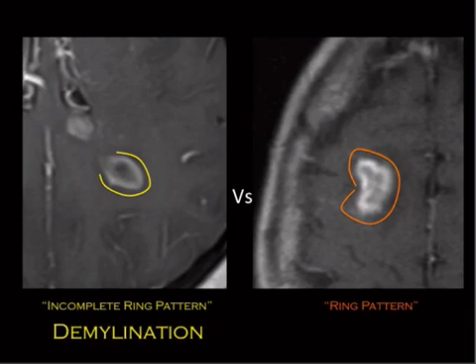Now, there's a bunch of different kinds of demyelinating stuff, and we're going to talk about that in this talk. But if they're going to show you demyelination on multiple choice, it's different in the real world, because in the real world lots of stuff can happen. But in the multiple choice world, you have to think like a Sith. Siths deal in absolutes. So you have to think, okay, boom, boom. We're going with Aunt Minnie stuff here.